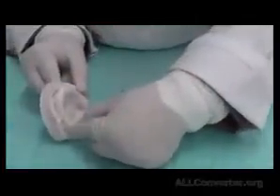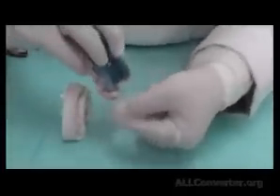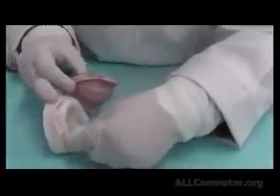I could add a step in the patient's mouth. I also could measure what we call the buccal pouch. So I go with my finger into the buccal pouch and record how long this length is, and then come to the cast opposite to the side, because this buccal pouch corresponds with this side. I go back to the impression and use that measurement. So it will tell me, did I go into the full depth of this sulcus or not? So I'm pressing inside the patient's mouth, I take a measurement, I compare it with the area corresponding with that, and I find that I have recorded it.